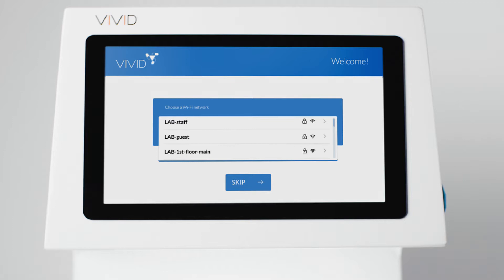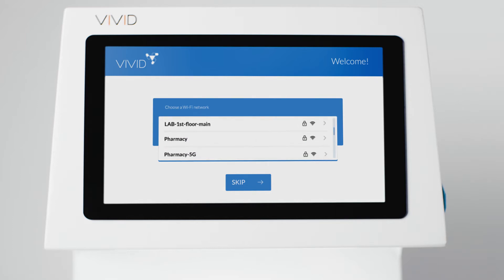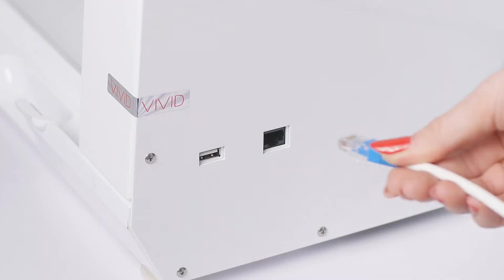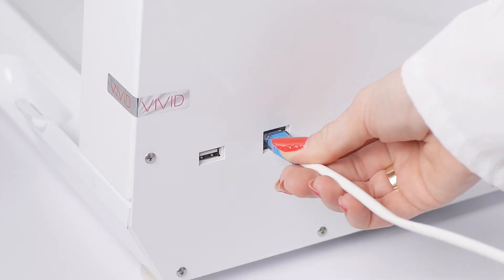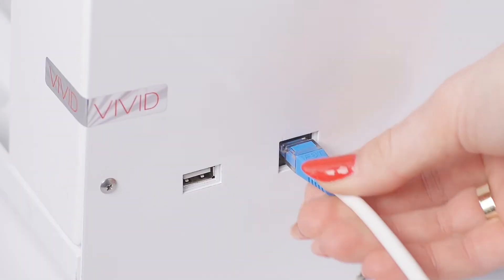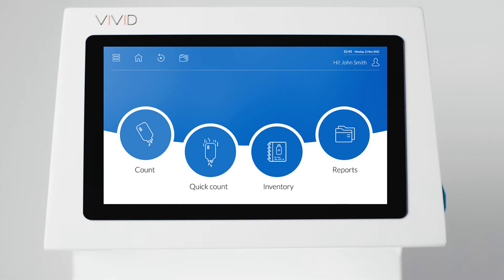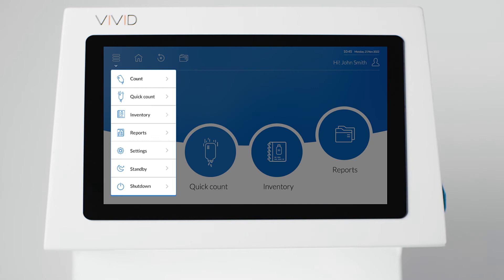Before you get started, make sure your Vivid is connected to the Internet. When interfacing, Wi-Fi is okay. However, some software providers may prefer or recommend Ethernet. With an active Internet connection, you are ready to start with configuration.